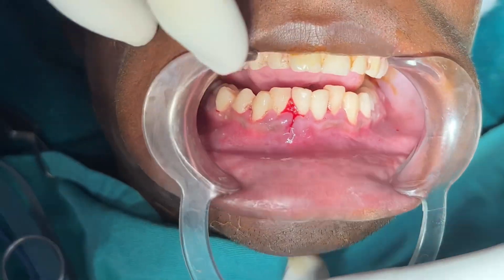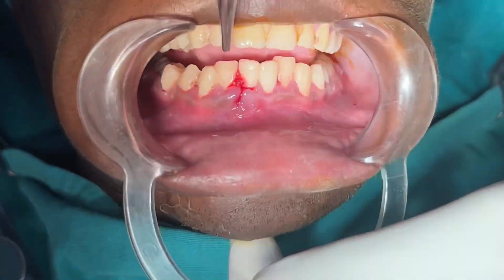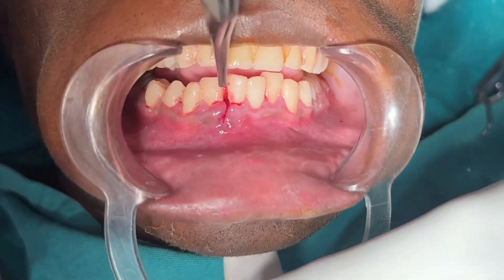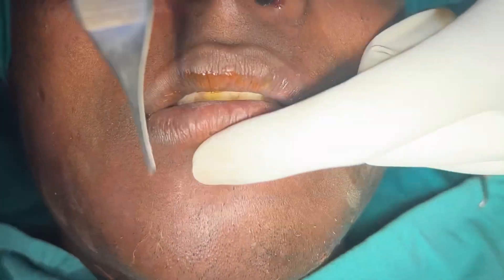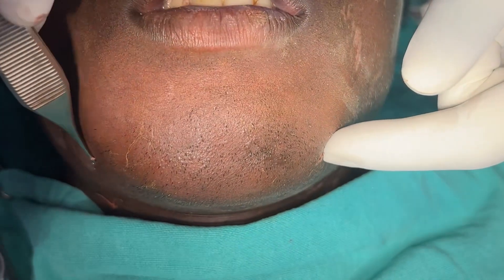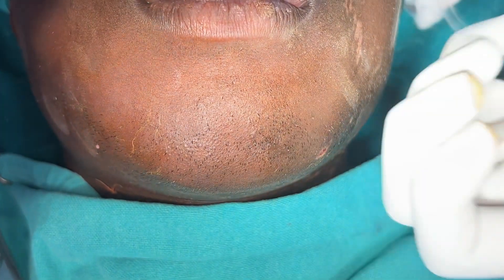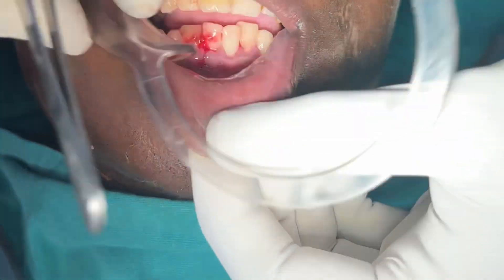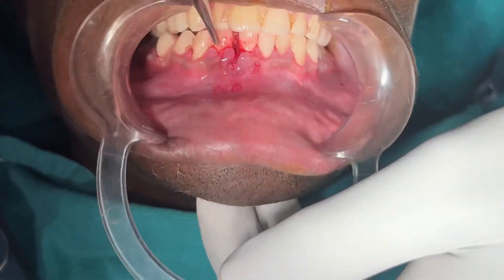What you're seeing here is a fracture of the lower jaw. This is one of the fractures sustained by this patient. There's another fracture literally running from one end of the mandible to the other, and that's moved down because of the muscles pulling in. We're going to be fixing both of these fractures for this patient.